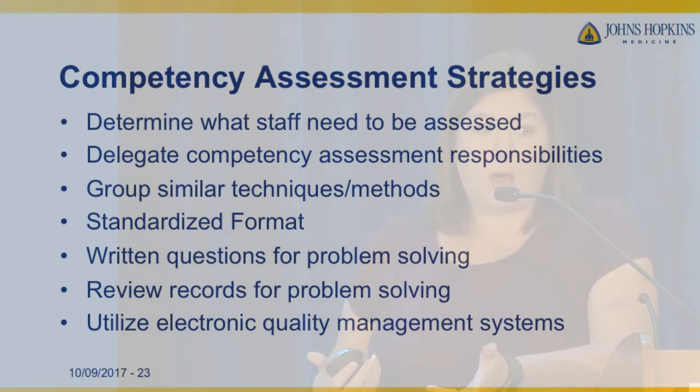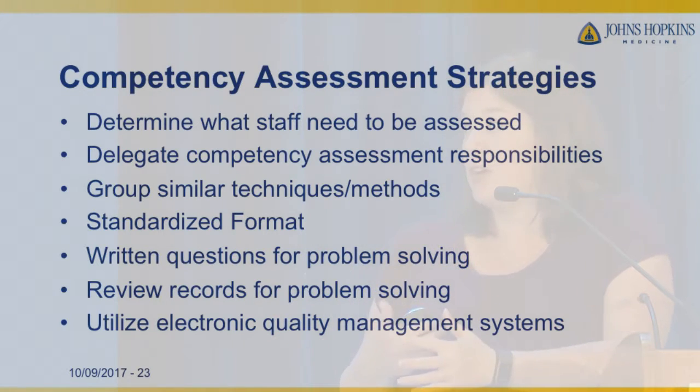You need to delegate competency, so Joan just mentioned how that's one of those deficiencies that keeps getting cited that she sees, and so how you can easily go about doing that. Then how do you get the work done with minimal effort? So I'm going to tell you how I kind of group similar things and how I group test systems together.